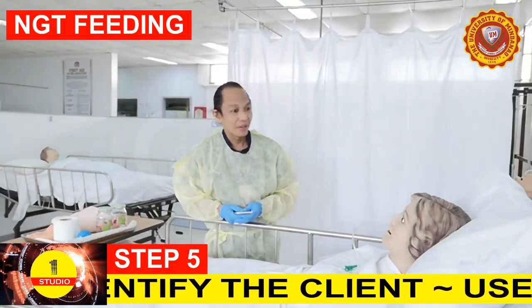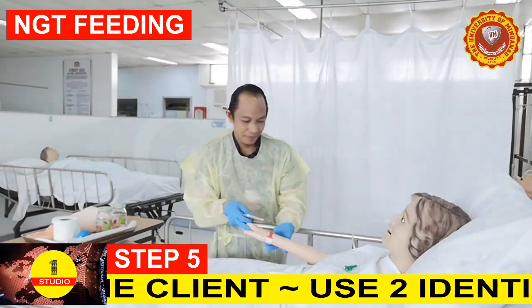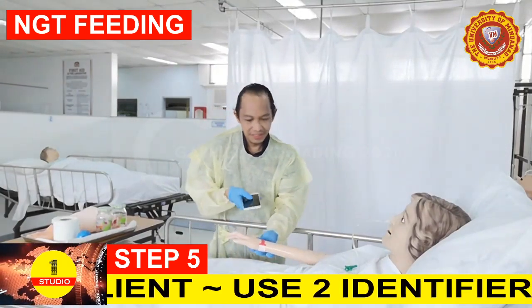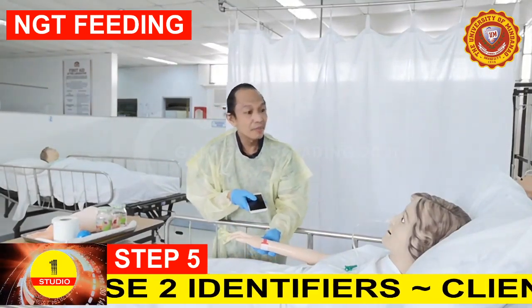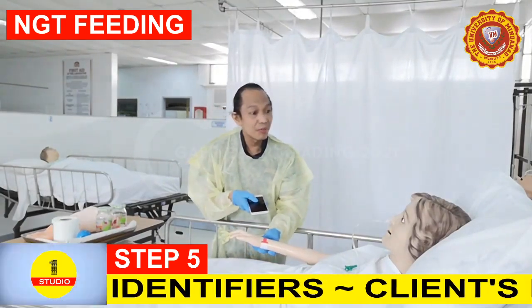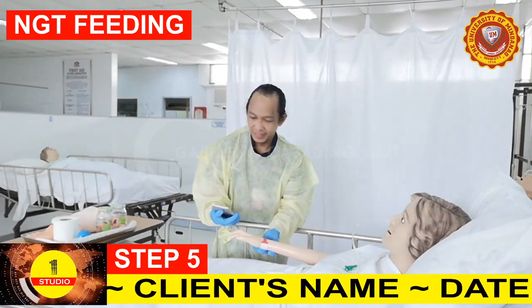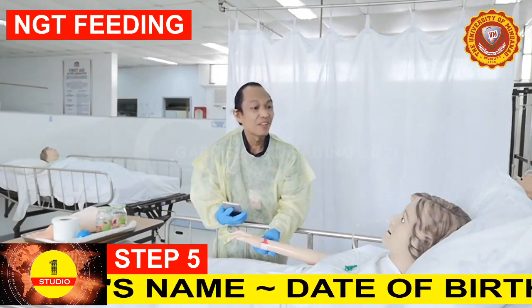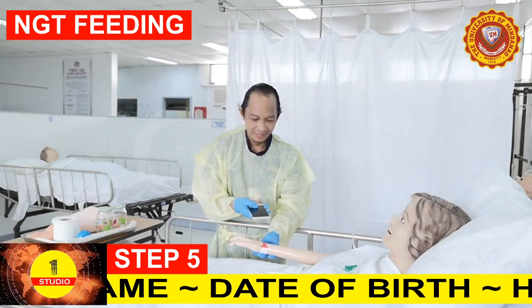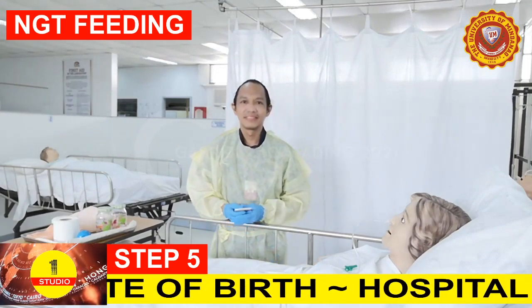Step 5. Identify the client correctly. Use two identifiers before performing any clinical procedures. Identifiers include the client's name, ID or hospital number, date of birth, and address. Also check the client's history of allergy.